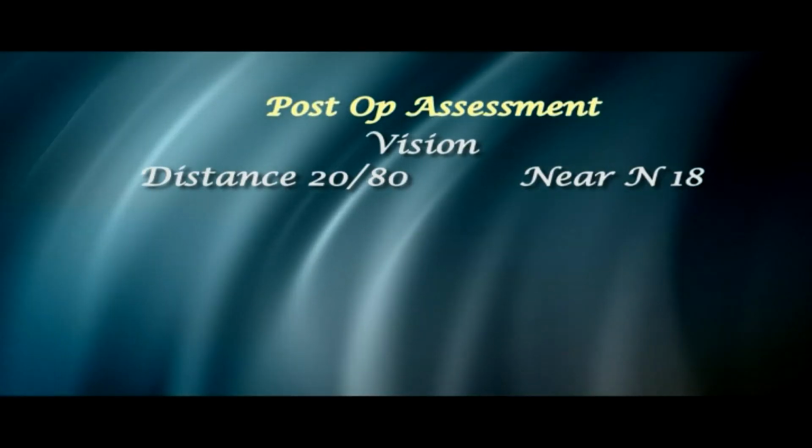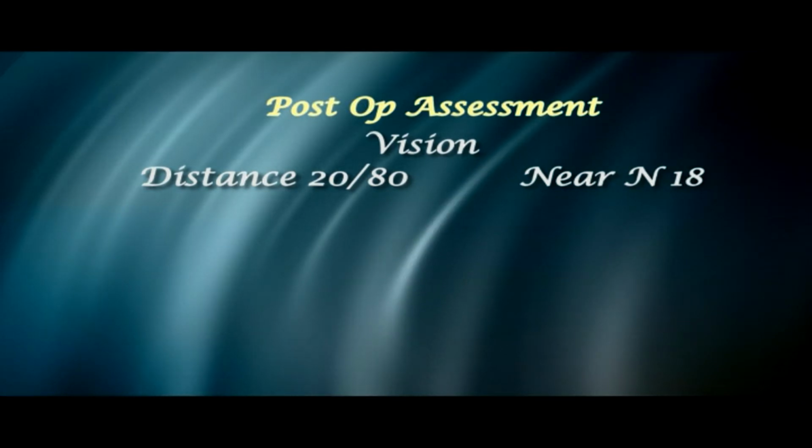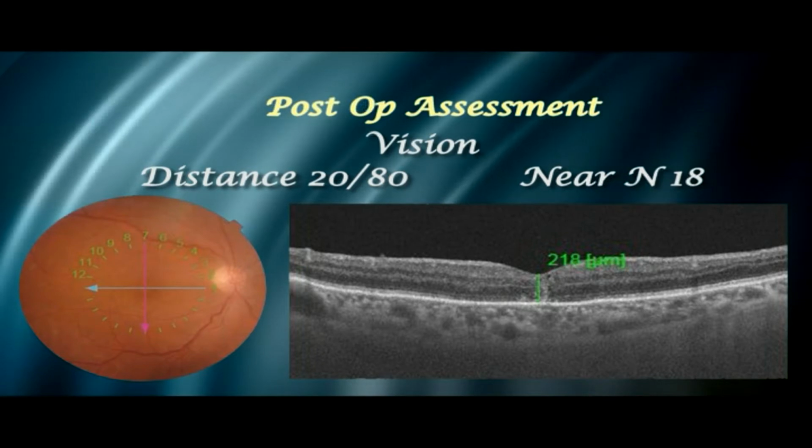1 month post-operatively, the patient's vision improved to 20/80 and N18. The OCT showed type 1 closure of macular hole. Finally, we present the technique of autologous ILM grafting.